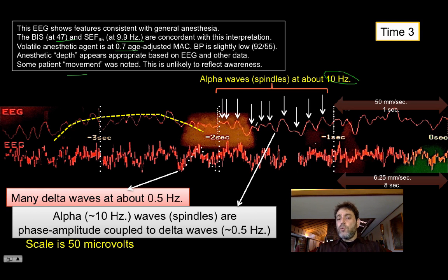The differences are nuanced, especially when you're not dealing with burst suppression or persistent suppression, which doesn't occur during physiological sleep. But some of the features, the persistence of the spindles, is more consistent with general anesthesia. The delta waves can be a bit more erratic with general anesthesia. And the slower spindles are also more common with general anesthesia than with physiological sleep.